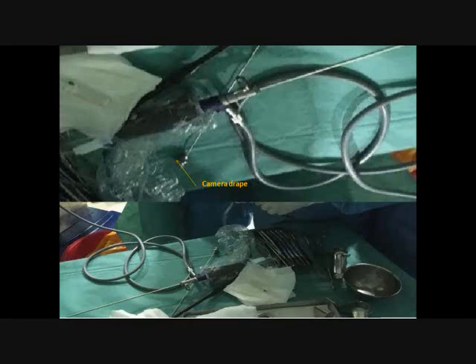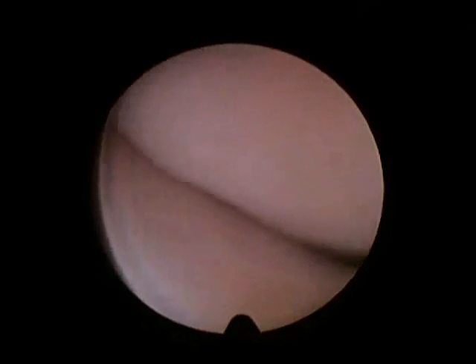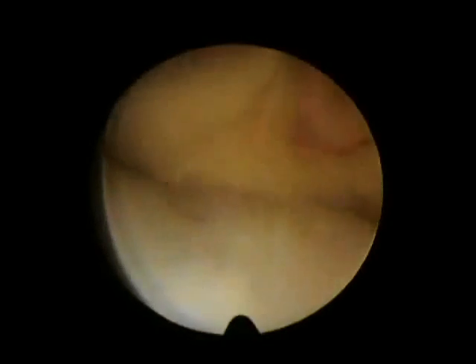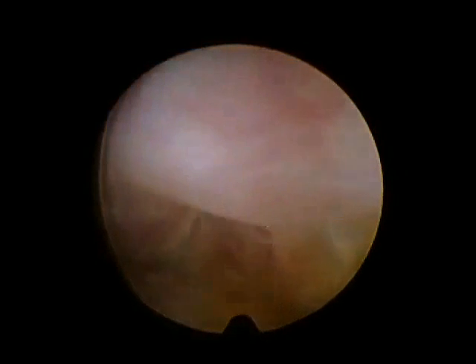So let's take a look at the video. So here we go. The saline is on. I penetrated the vagina very quickly. Beginner's mistake. Then I remembered that I had to be slow. See? Slowly. Then I forgot again. So quick again. And here's the cervix. I realized that I had to be slow.